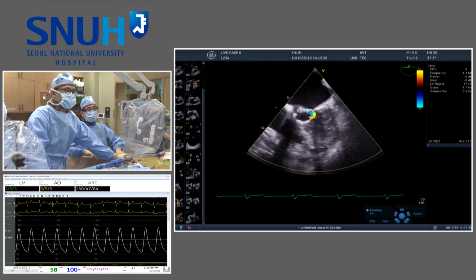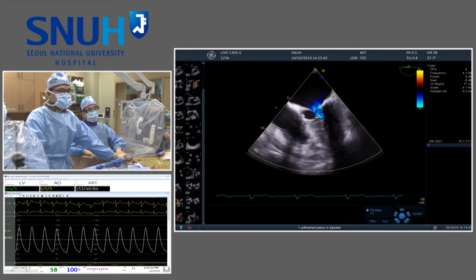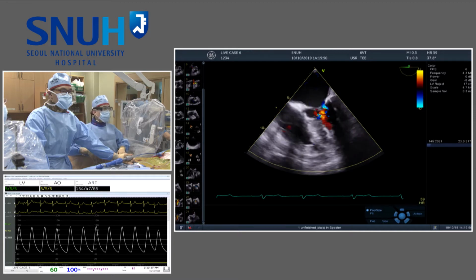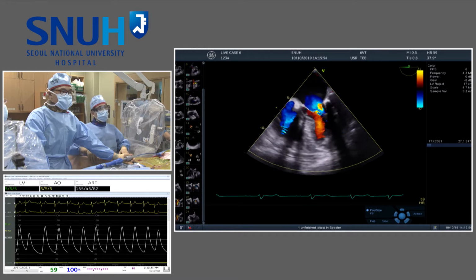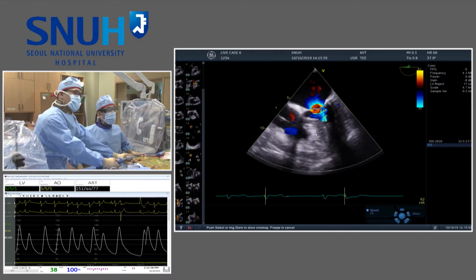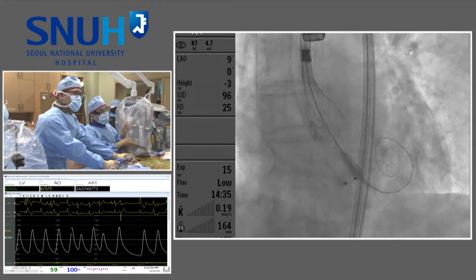I think because the valve touched the mitral valve, the anterior leaflet, it can make some functional MR. You cannot usually respect this right now, because first of all, the implantation is pretty high. So you do not suspect that they are touching the mitral apparatus? But the long axis will actually show the tip of the valve touch. I know, but it is still during the implantation. You cannot appreciate it.